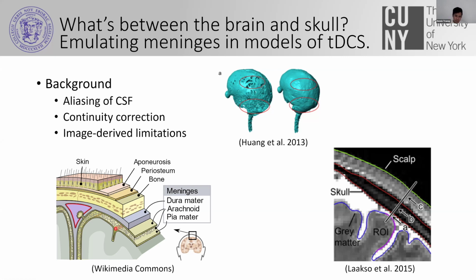Now, there's different ways we could maybe address this. You could upsample scans, but that has challenges as well. These are usually voxel-based meshers. Because they're voxel-based, if we were to double the resolution, it's really a cubic function. It would be doubling in the XYZ direction. A 2-fold increase would be an 8-fold increase in memory. And it gets restrictive as we keep upsampling.